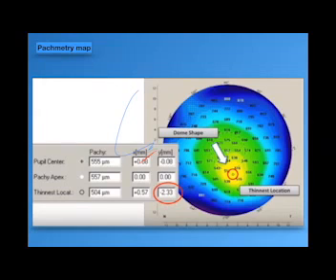Yesterday, I had a meeting with a lot of clinical cases and discussions about this issue, and the presenter showed identical twins. In the identical twins, we found that one of them has in her eye inferior steepening, which is more than the other eye, but both are in the same range.